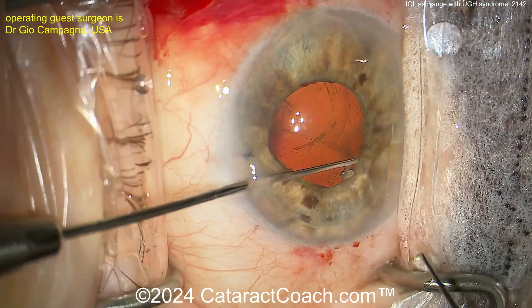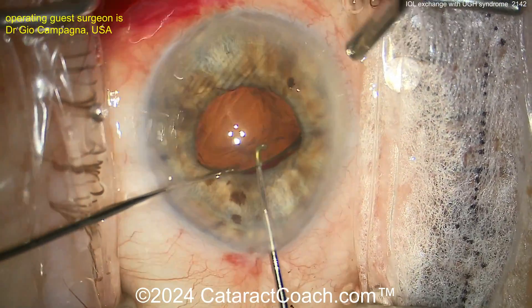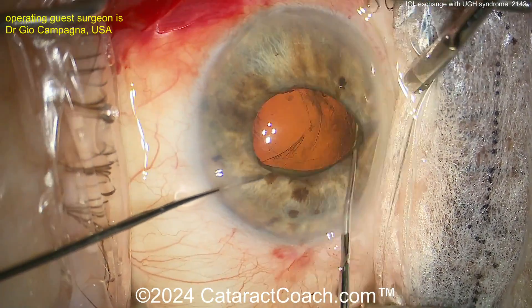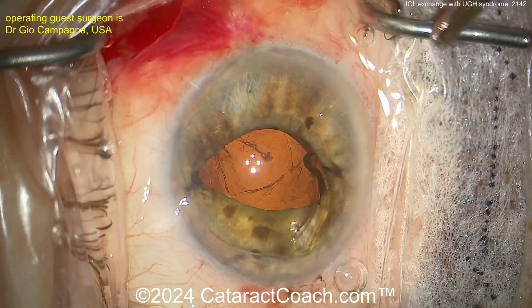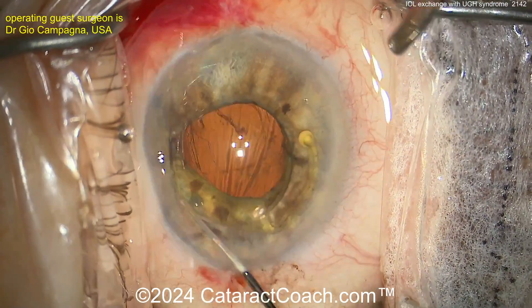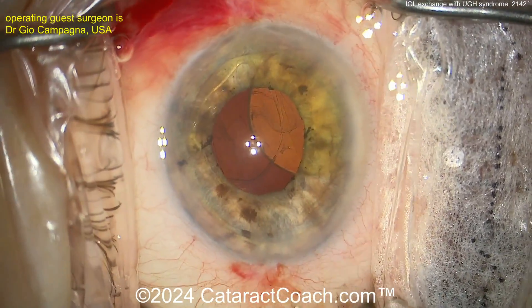Maybe if there's an intact capsulorrhexis, you can do an optic capture with a three-piece lens. But you're going to have to get this lens out. This patient also has some chronic glaucoma from this. Here's the two-hander technique — I like this Sinsky hook in one hand and maybe a manipulator in the other. Getting that lens dialed up out of the sulcus and bringing it up into the anterior chamber. Get that other arm up. Get that whole lens on top of the iris.